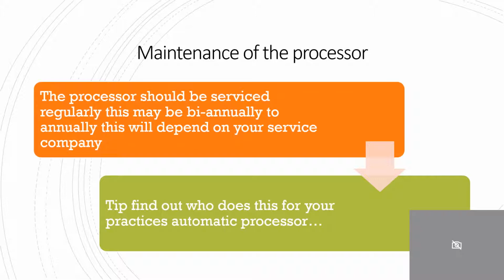Maintenance of the processor. The processor should be serviced regularly, and this may actually take place annually or biannually, so that would be twice yearly, and this will depend on your service company. If you have this type of processor and you're not aware of your practice procedure and how often it is being serviced, it's worth finding out who does this for your practice's automatic processor, as you may be involved in arranging such calls for services to be carried out, or also for such companies to come out if you were to have an issue with your processor.